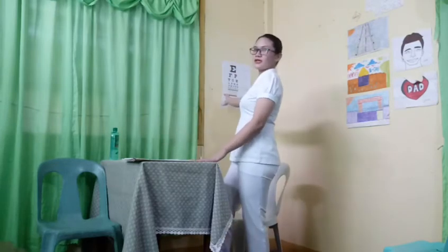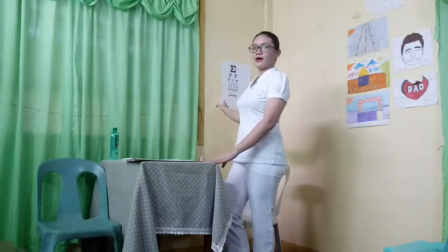Okay, so now that I have enough background about my patient, allow me to share with you the things that I have prepared for this assessment. The first thing that I prepared is the Snellen's chart. This is used to check for visual acuity of my patient.